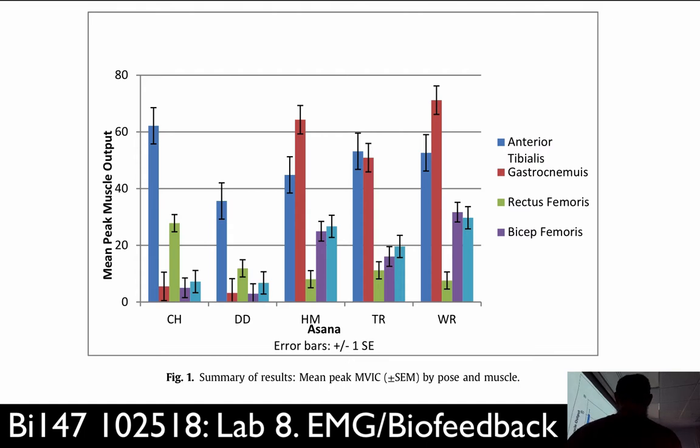What's the, which? Oh, this muscle is glute medius. The light blue column is glute medius. They also looked at glute medius engagement. And it should have hip adductors, like the gracilis and adductor longus, if they were going to really have it in antagonistic pairs, but they didn't have any antagonist data for that, and I didn't really want to deal with wrapping electrodes on the glute and adductor. Keep it easy. So we'll just do these.